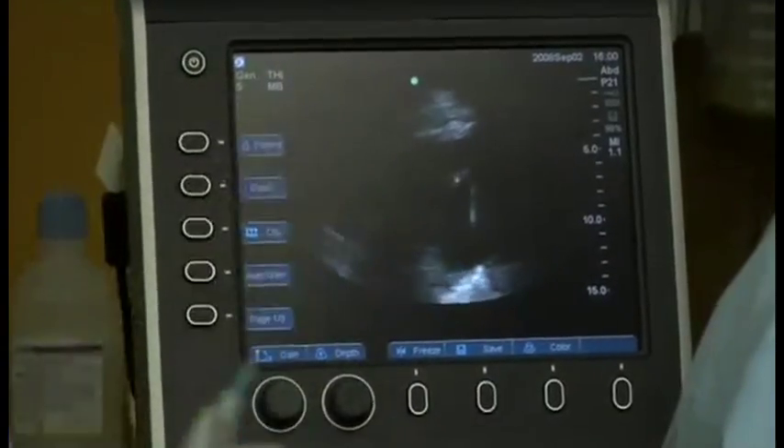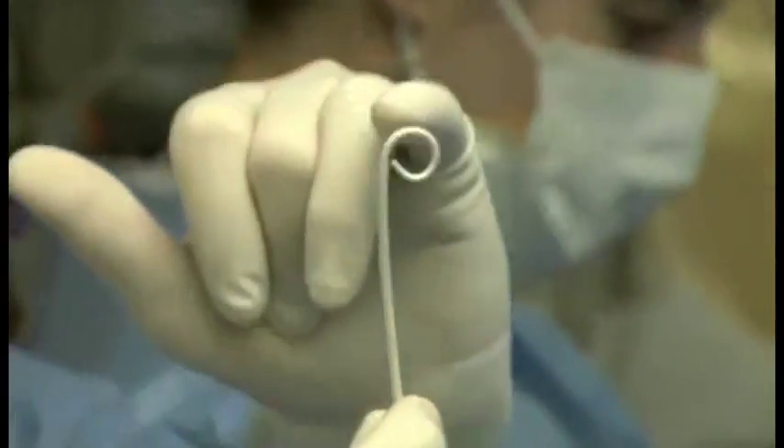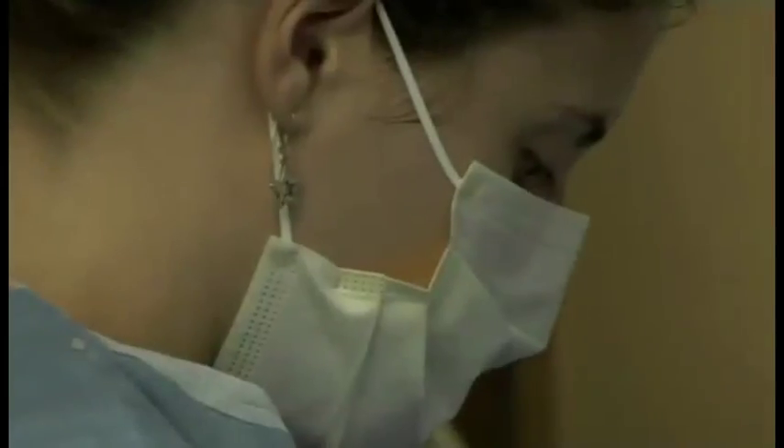In just a few minutes we changed our entire approach. We don't have to move him to do a CT scan, we don't have to put in unnecessary needles — just the catheter we're placing right here. We know exactly where we're heading, all at the bedside.